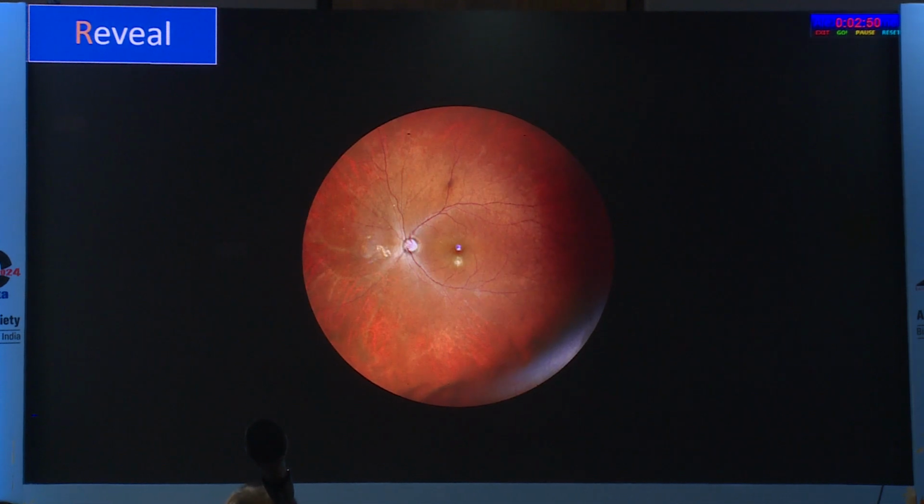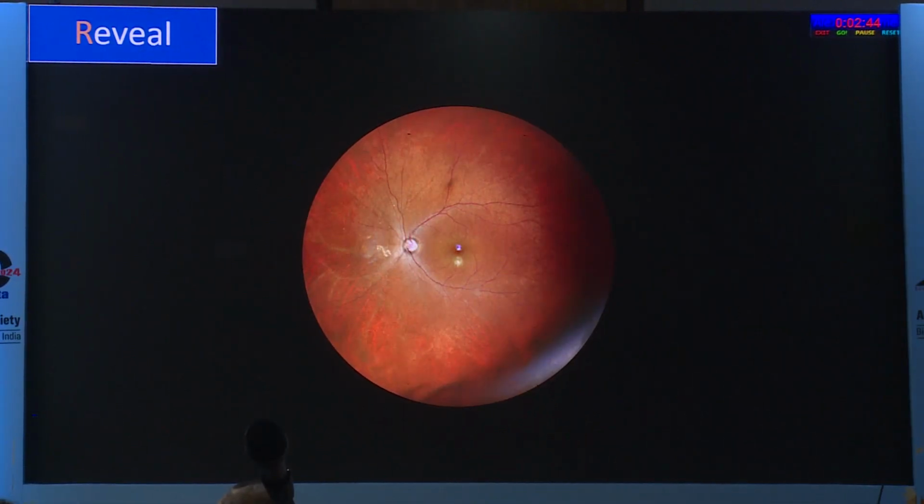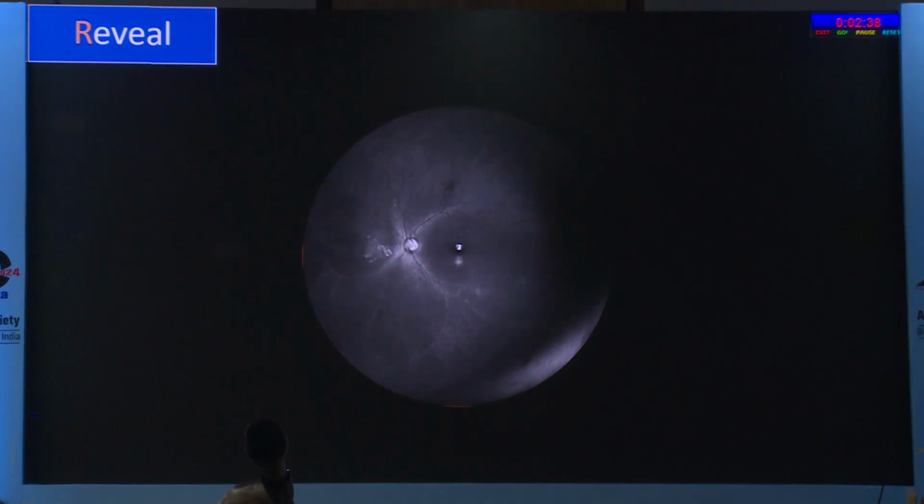Yet another area where it scores over conventional imaging is in subtle cases of vasculitis. As in this case, we might brand it as normal. I had a suspicion of vasculitis. The blue reflectance image clearly shows the areas of vasculitis in the periphery much more clearly.